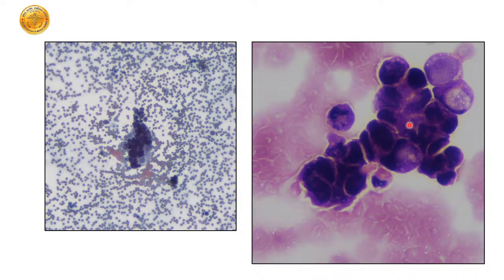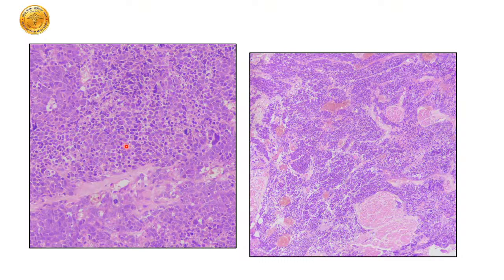So this was another case which came in urinary cytology. Very crazy looking cells, very high NC ratio, some sort of molding or windowing or whatever you want to call it. Very neatly packed with each other. I would rather call it molding than anything else, right? Very high NC ratio. This is pixelating, not showing here, but very hyperchromatic, as you can see here on the Papanicolaou stain. Very high NC ratio, very hyperchromatic, right? Next slide, please. I want to show you the histology for this.